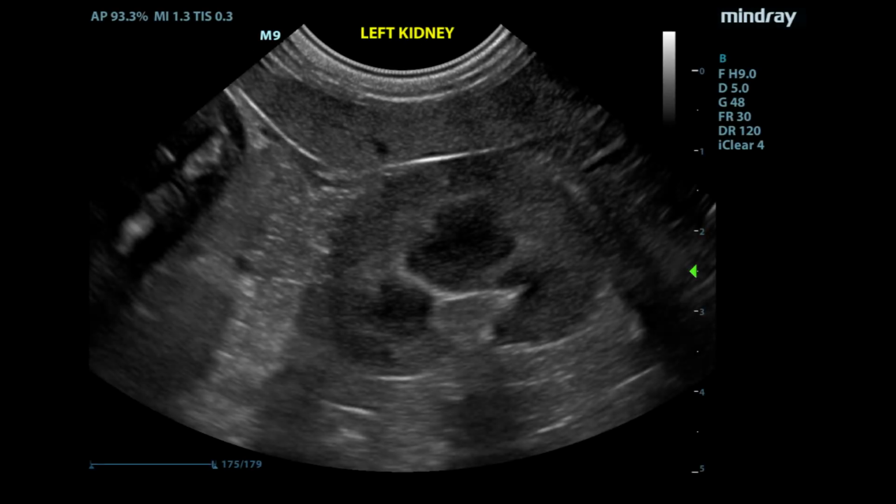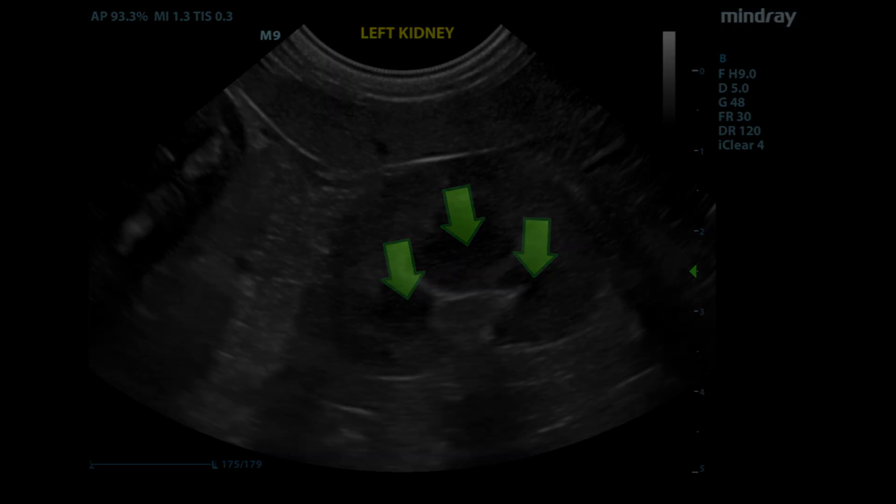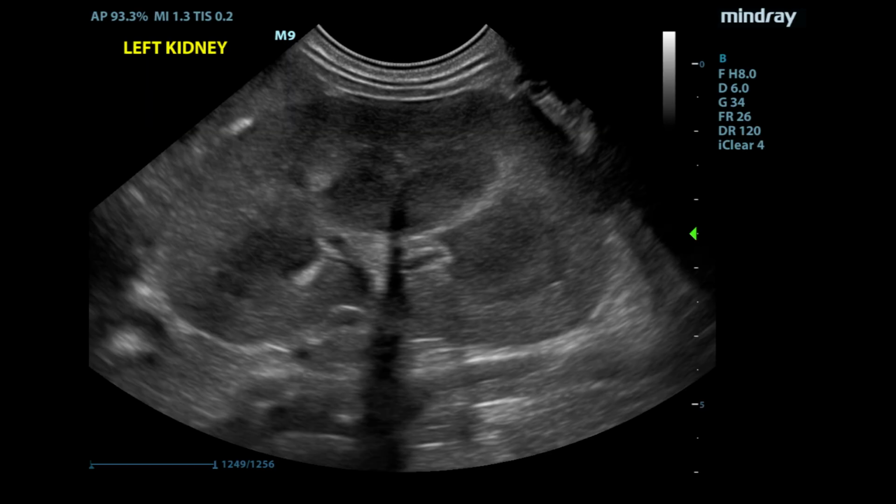Kidneys are encapsulated organs with two primary densities: a homogeneous, relatively hyperechoic cortex and a hypoechoic medulla. In a normal kidney, anechoic tubes of the parenchyma usually represent renal arteries and veins. Ureters are usually too small to see in normal kidneys.